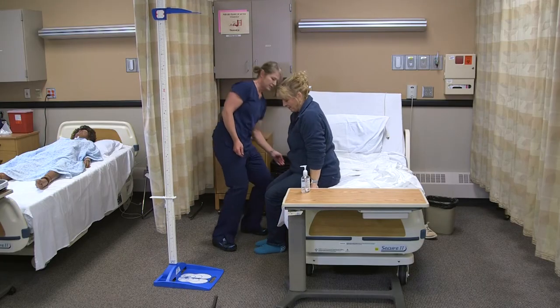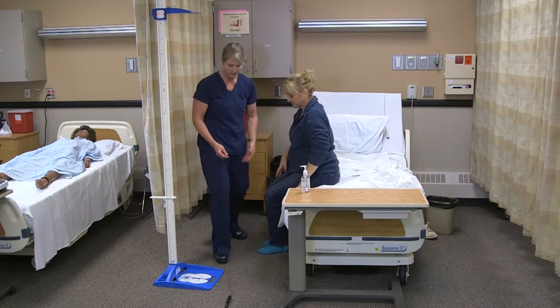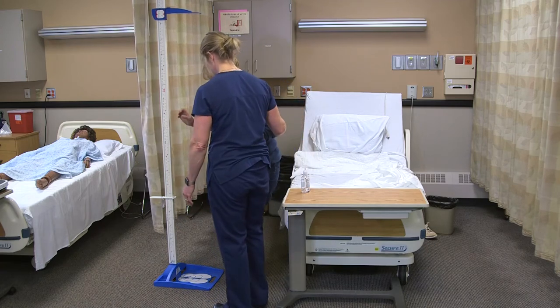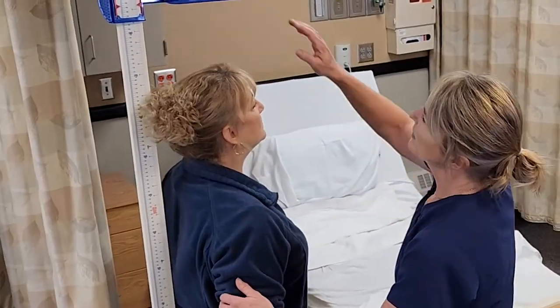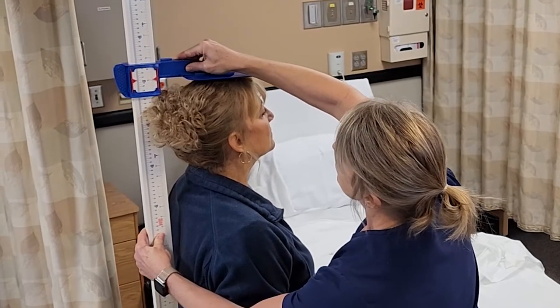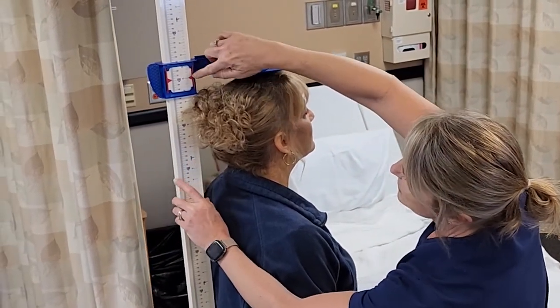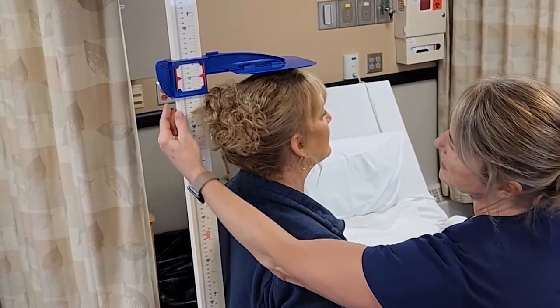I'm going to make sure the bed is all the way down and let her dangle a little bit. Are you dizzy at all? Okay, I'm going to help you get over to the device and then you can turn. Keep your head up, and I'll put this down just to the top of her head — and it's measured here. So it's five feet seven inches, or 67 inches. I could also document 170 centimeters.